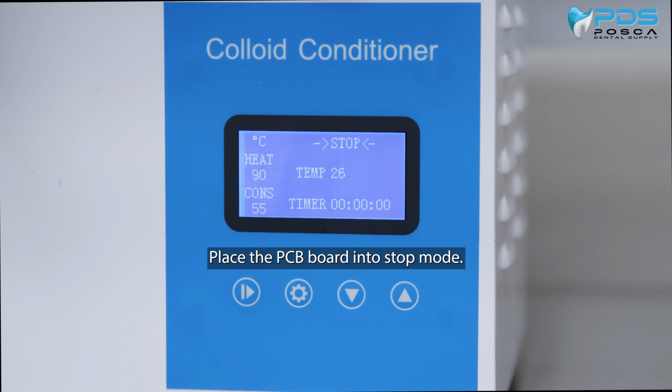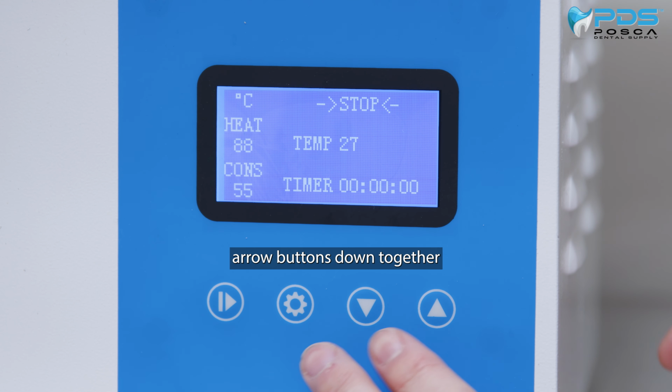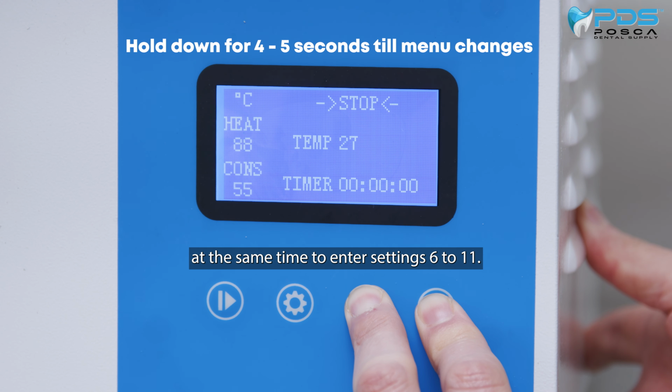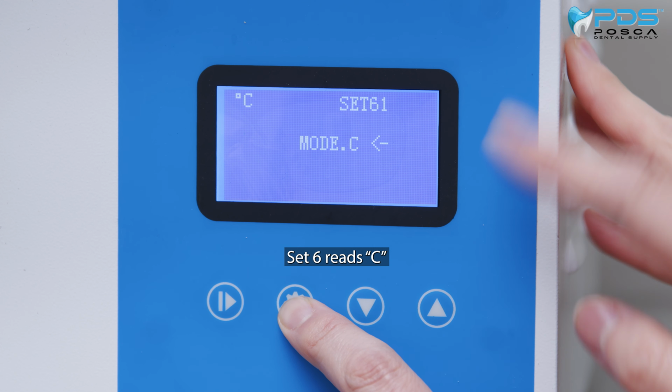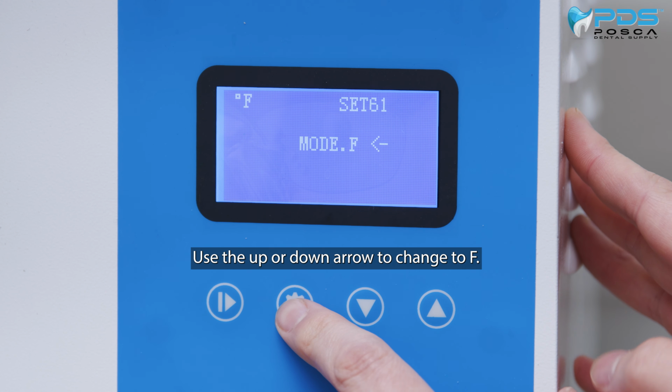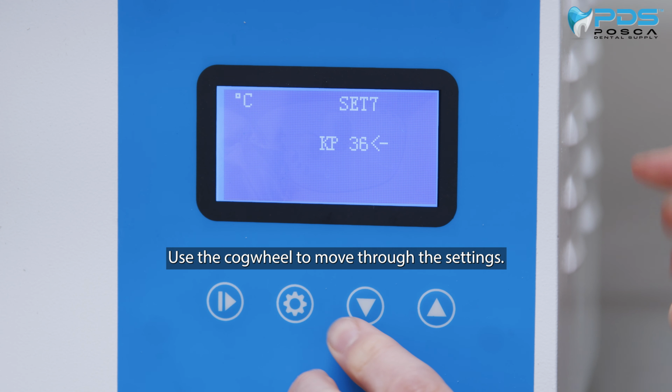Place the PCB board into stop mode. While in stop mode, hold the up and down arrow buttons down together at the same time to enter settings 6 to 11. Set 6 reads C. Use the up or down arrow to change to F. Use the cogwheel to move through the settings.